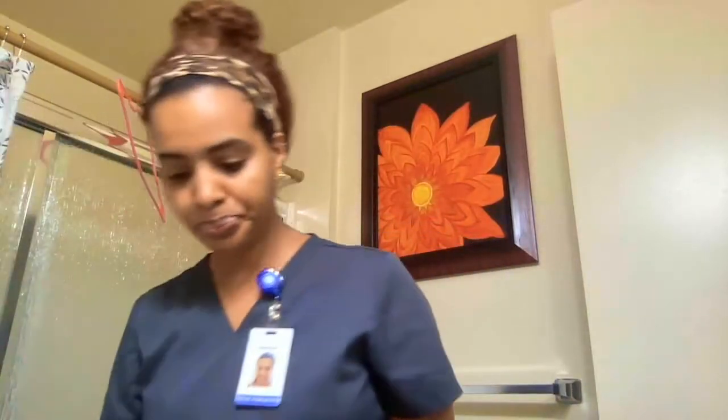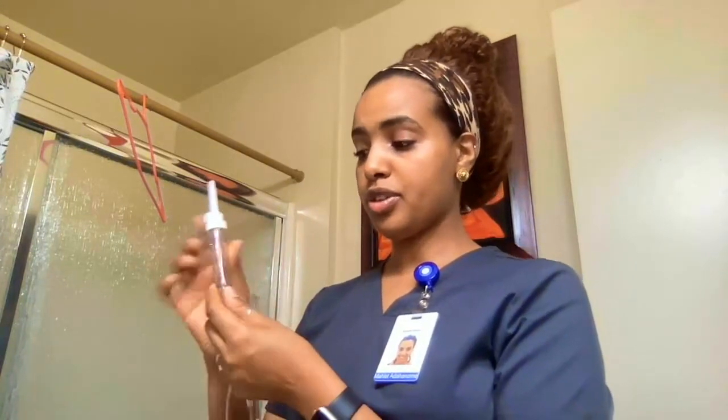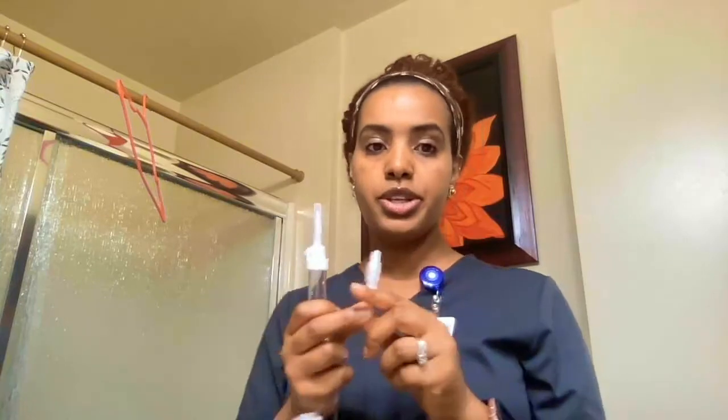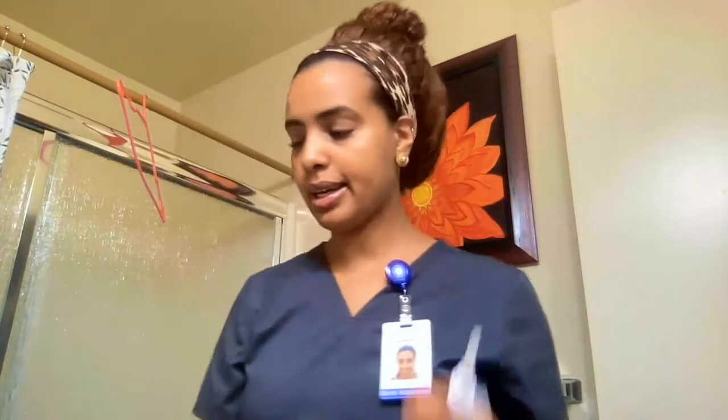I also have an extension for my IV and two tubings — one for my secondary and one for my primary. Let me tell you what each part is. This is the spike for the IV bag, and this is the drip chamber where we can see the drips and the fluid going into the patient. We also have the roller clamp, which controls the flow, and the Y-site or medication port — this is where we connect the secondary bag. And this end of the tubing connects to the patient's IV site.